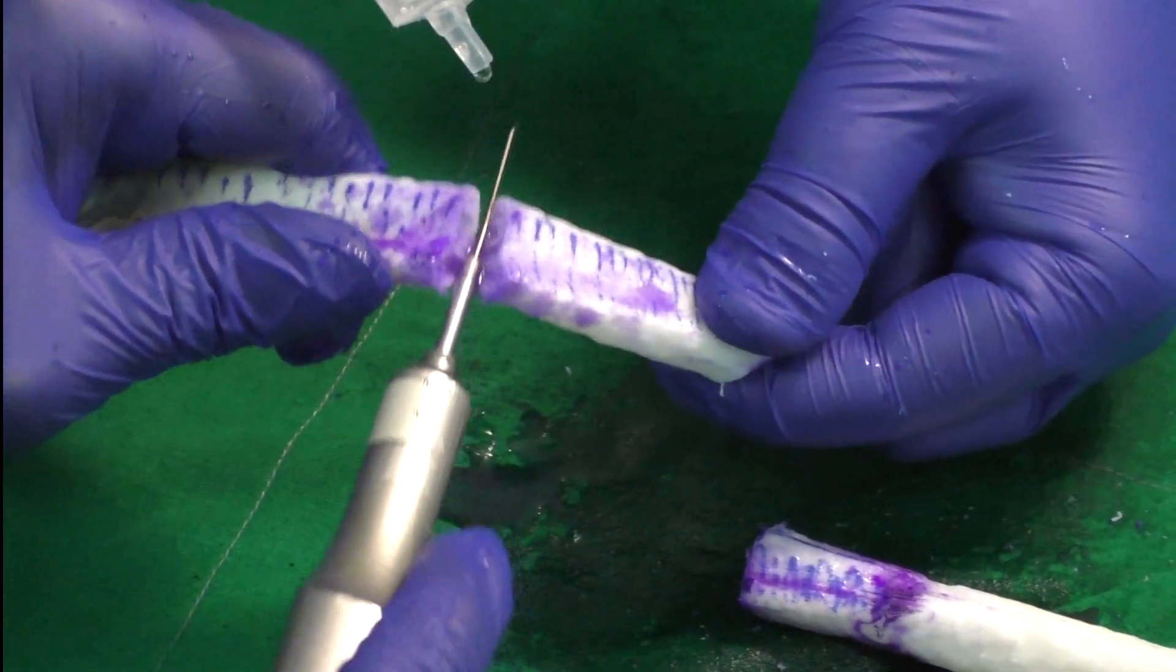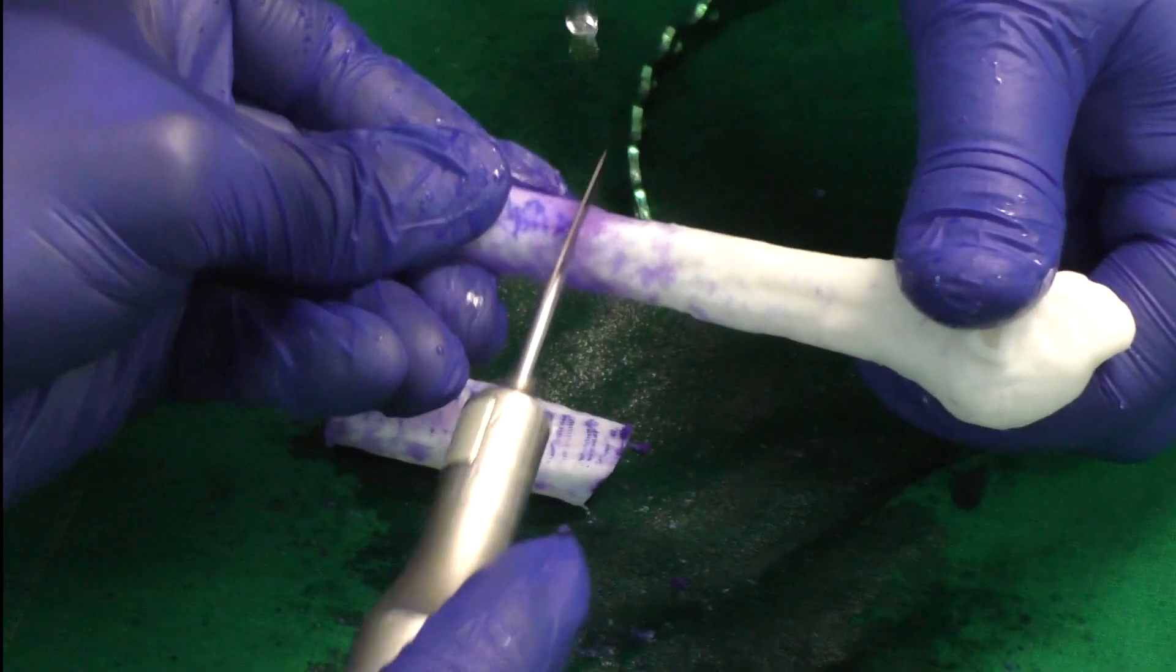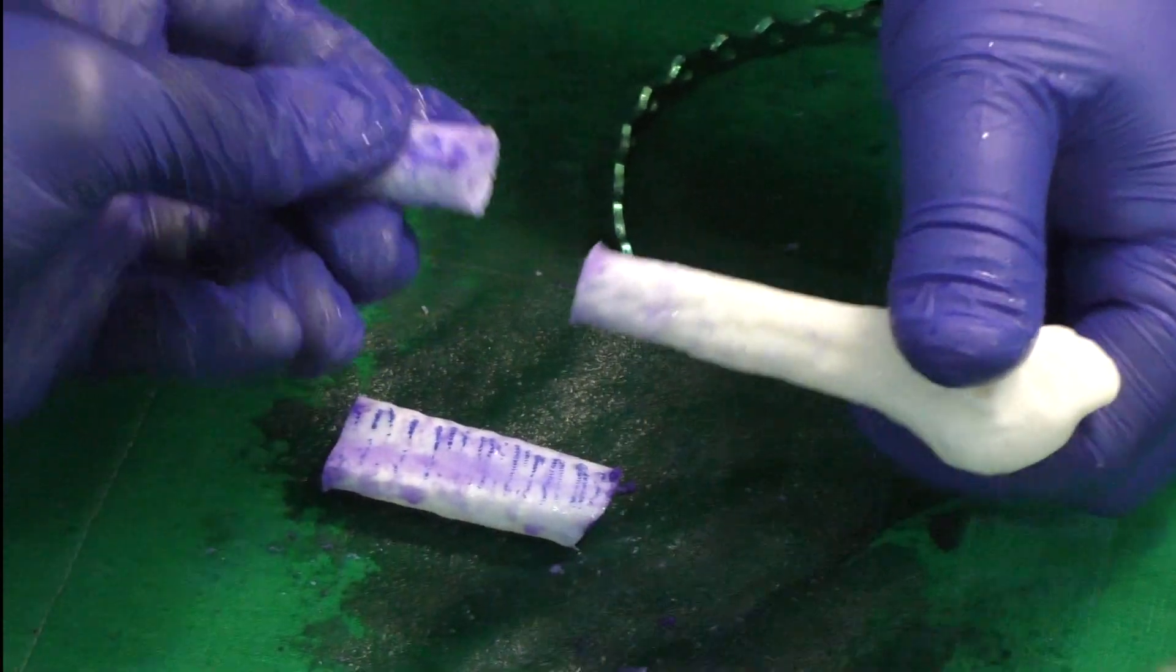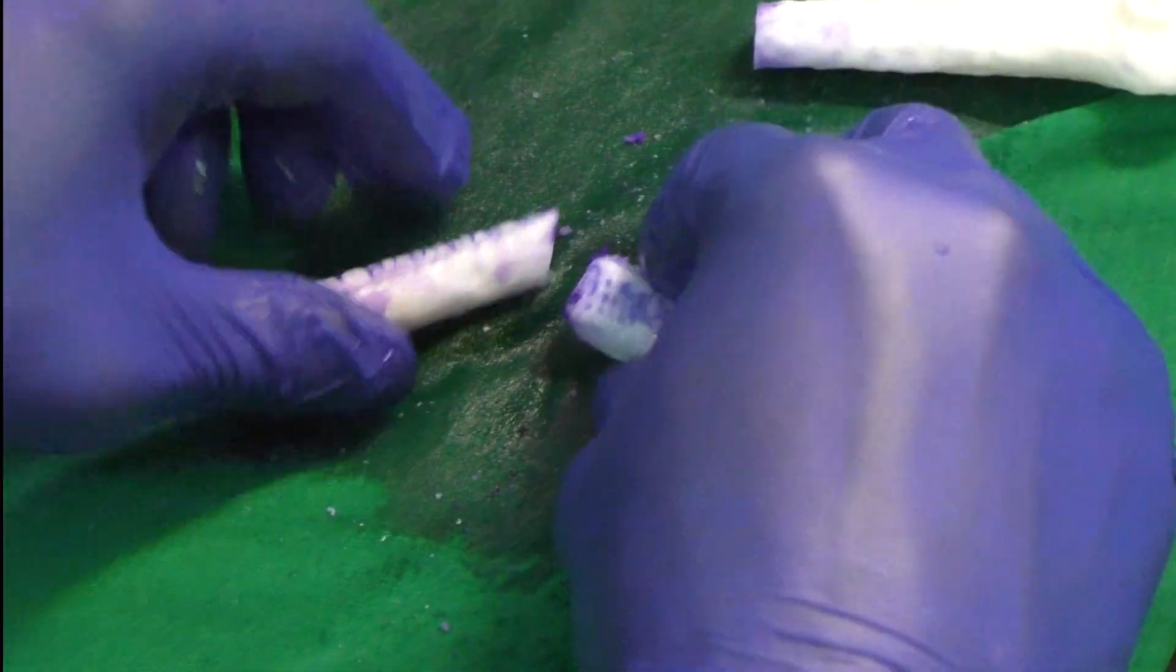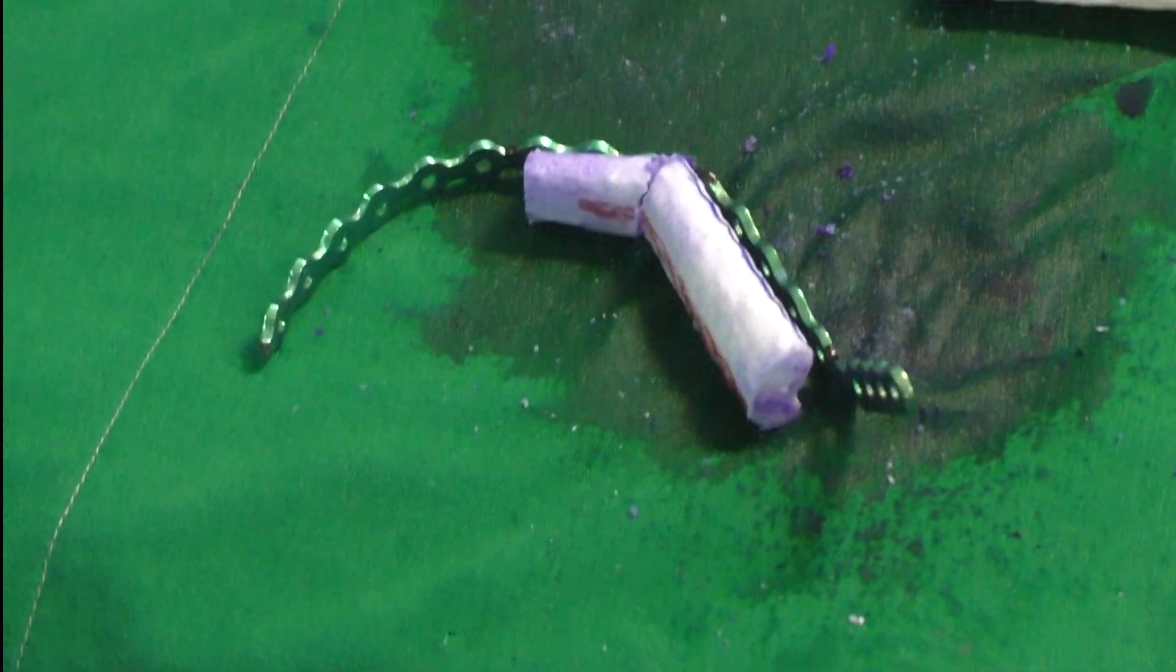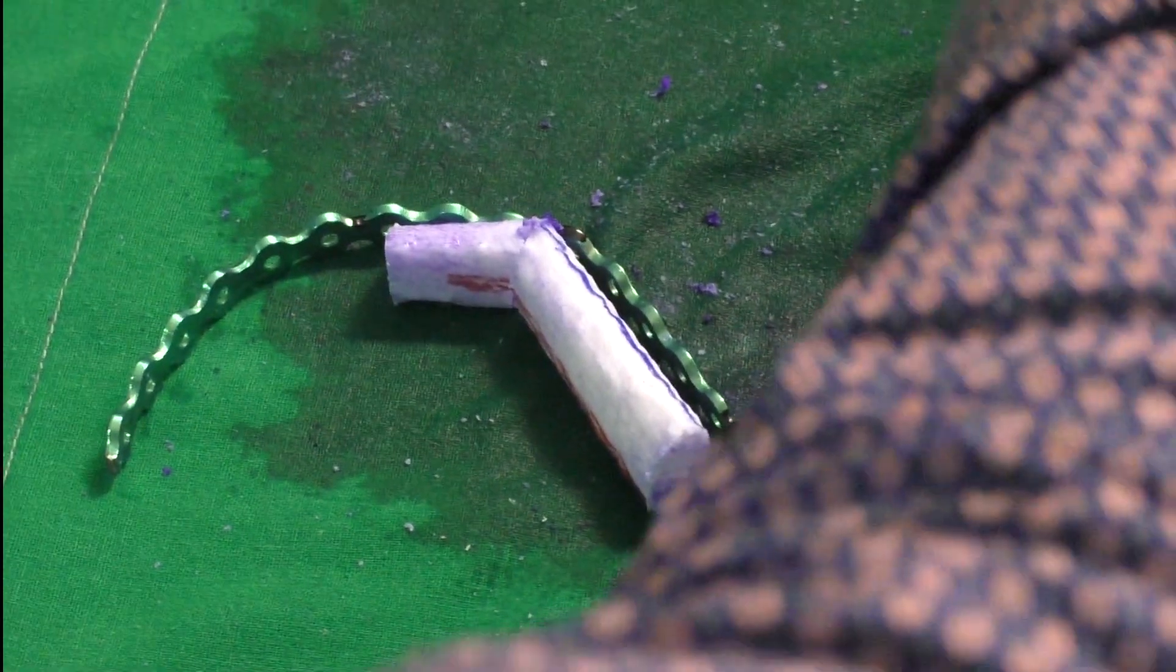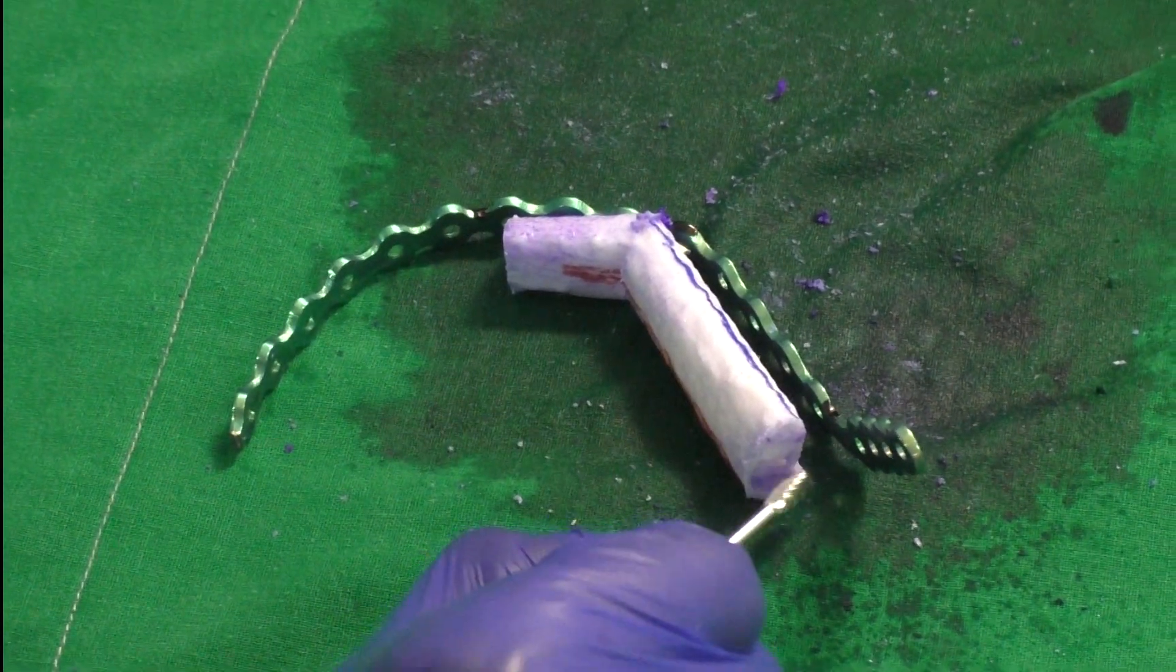Now the proximal and distal bone cuts can be angled in a way that they make best contact with the native mandible. Here we see that the osteotomized segments align well within the plate. The pedicle surface is medial, the peroneal surface is lateral, and the septal attachment is superior. If need be, the ends of the bone can be cut with a saw for better fit or trimmed with a burr, which can also be used to improve the bone contact between the osteotomized segments.